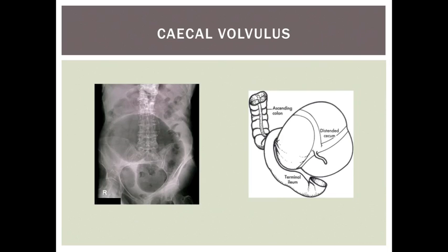Caecal volvulus is a rare x-ray finding. A twist occurs in the ascending colon that leads to a massively distended caecum. The apex of the volvulus points towards the left upper quadrant, and urgent surgical decompression is needed due to the risk of perforation.